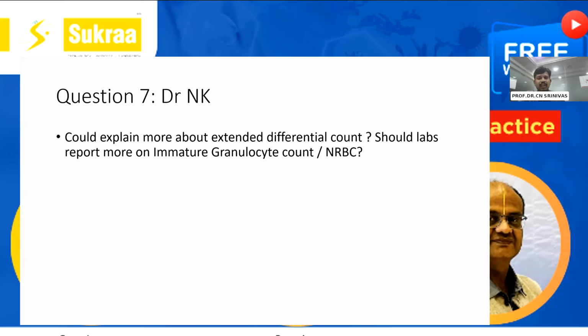So I would say as a routine practice, it is not required, but definitely in special conditions, especially when the flags are there or when the count is really high, we may have to call up the clinician and ask for the history and correlate it, and we definitely have to mention whether NRBCs are there. And when NRBCs are there, we also have to give a corrected WBC count, because the count will be falsely elevated as these nucleated RBCs will wrongly be counted as WBCs.